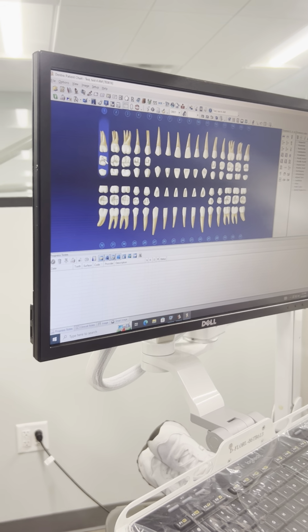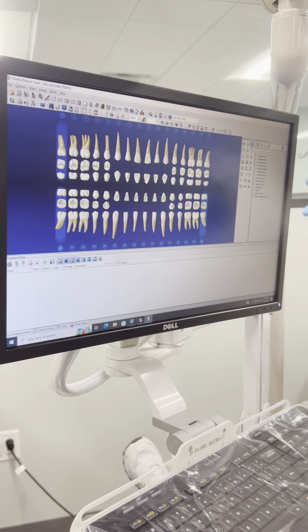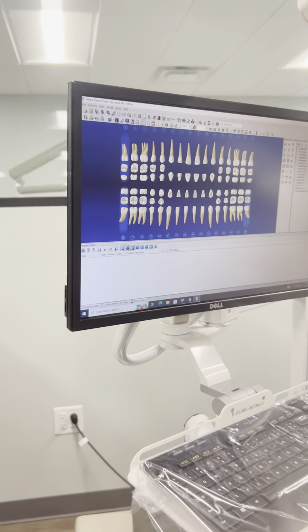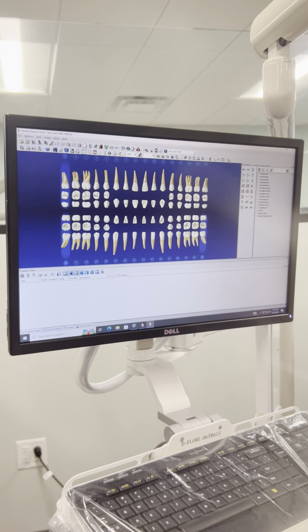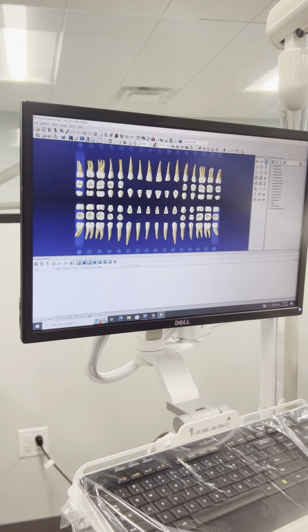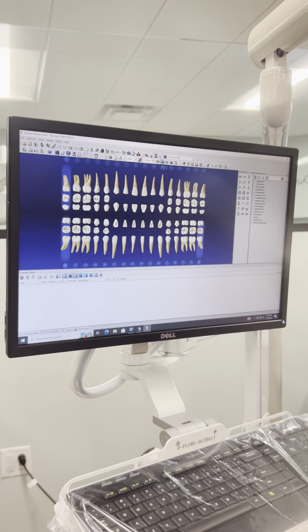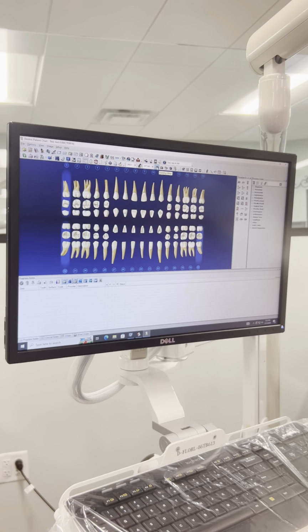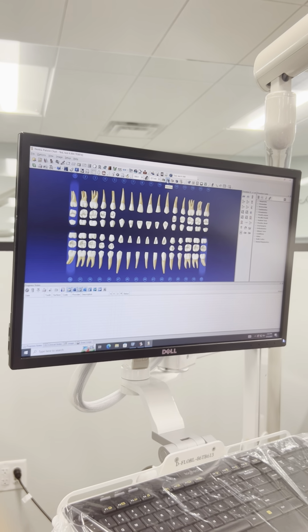So I'm gonna click on 1, 32, 17. I have some icons here like extraction, amalgam, restoration, or I can find them here too. Restorative, endodontics, perio, oral surgery. Okay, so in this case, I'm gonna click here for extraction. I click there, and then we have existing other or existing or treatment. Existing other means this procedure has been done out of Concord in another place. Existing means it has been done here. So everything is existing other.